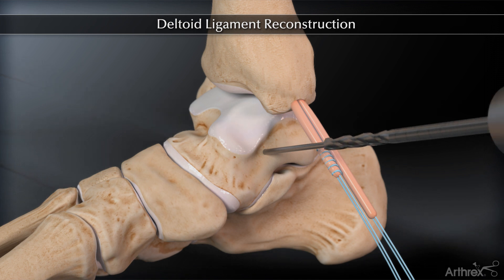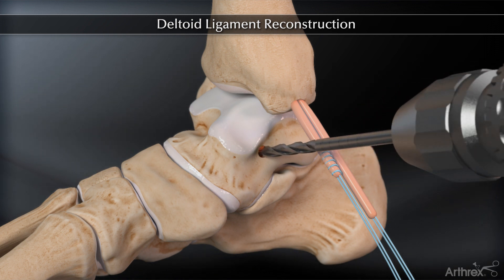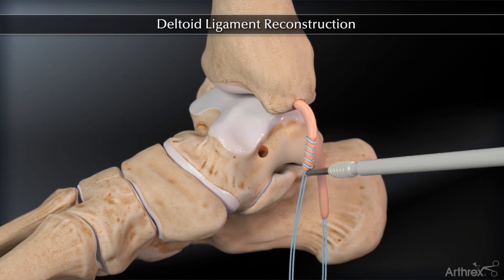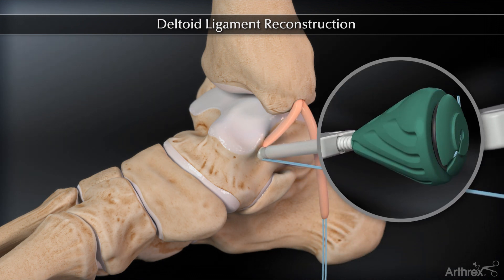The guide pin is overdrilled to a depth of 17 mm. The graft will still slide through the tibial tunnel. Pull on the posterior limb of the allograft to shorten the anterior limb. Insert and fix the anterior limb of the allograft, which has been previously whip stitched, into the talus using blind tunnel tenodesis technique.